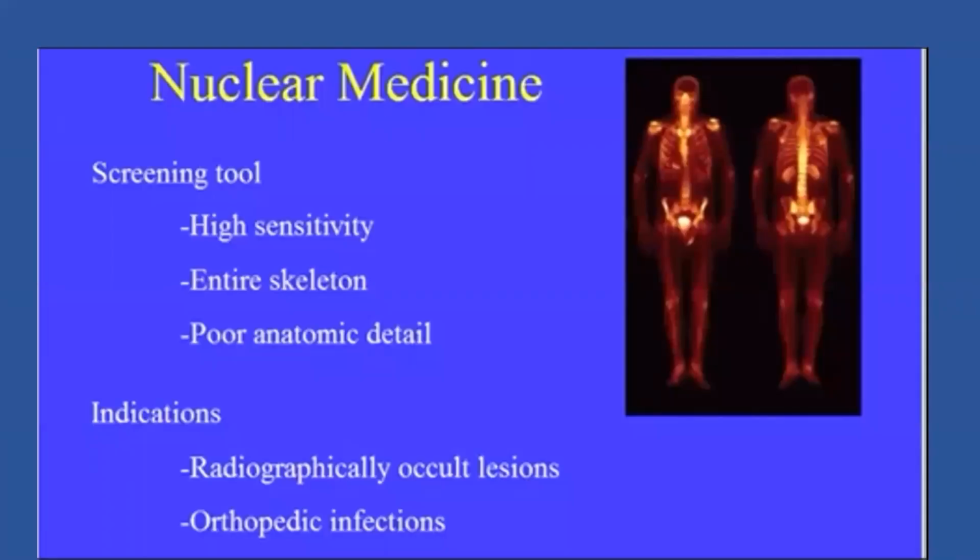Nuclear medicine, don't forget, it's a good screening tool. It can screen the whole skeleton, but it doesn't give us detail on the anatomy. Its indications are for radiographically occult lesions and orthopedic infections. I put this slide up. Don't forget it. Never forget it.